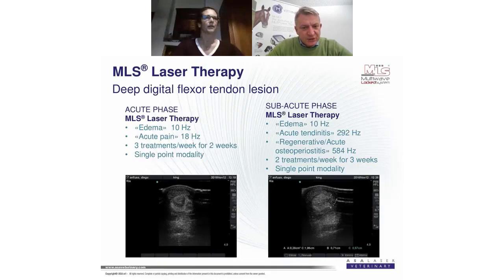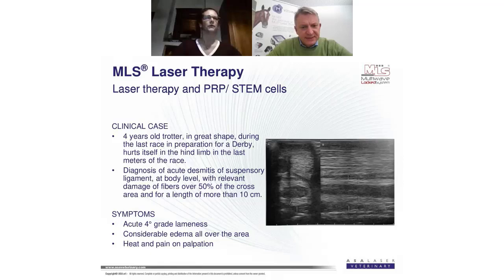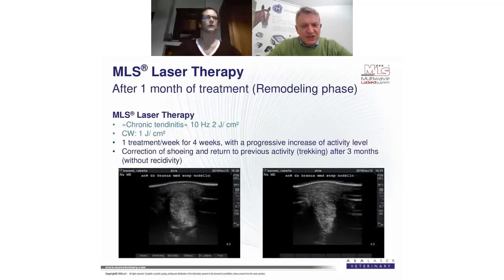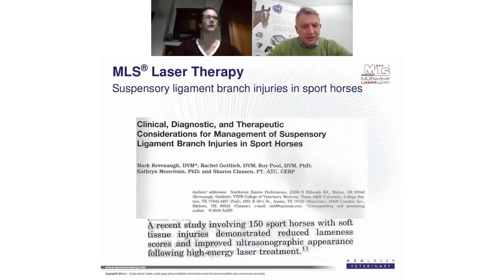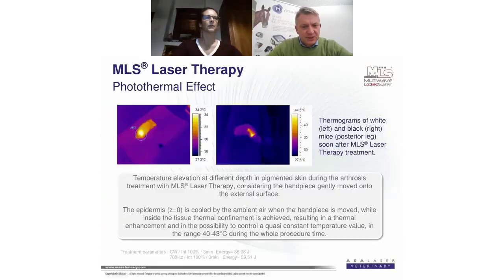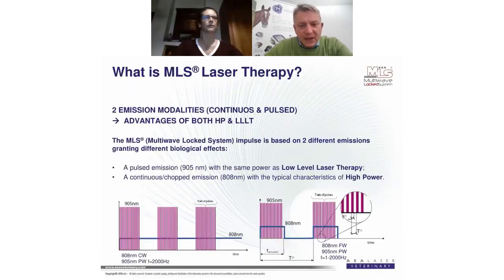There is a technical question, and for this reason, let me review a little bit of the presentation, because I need a slide. One participant is asking what is the difference between CPW and FPW. Let me go to the slide. Okay, so basically, what is the difference between CPW and FPW? Most of the protocols are set in the FPW. What does it mean? We are in the modality on the right.